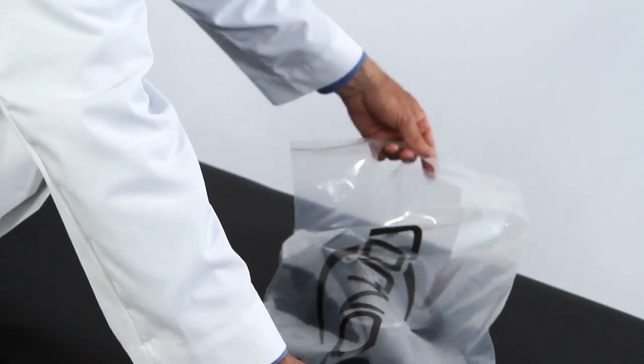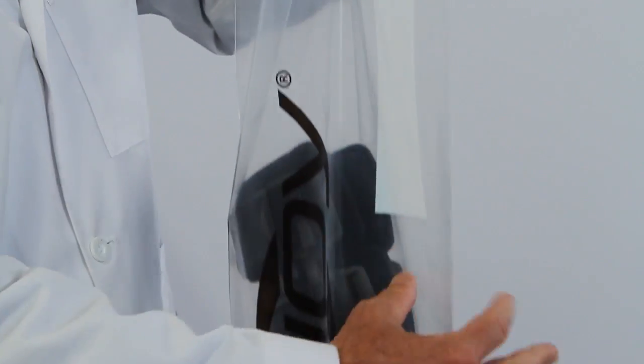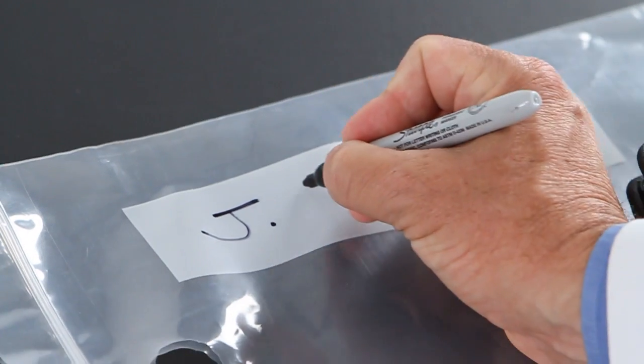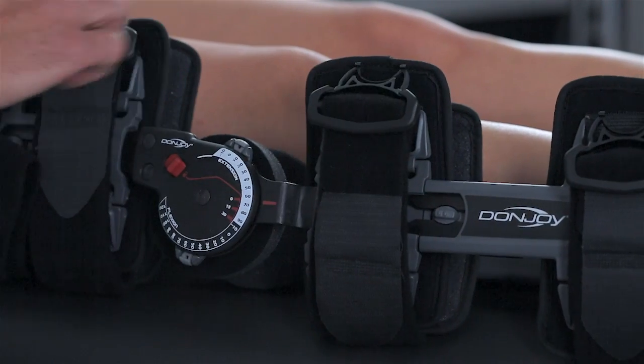The Exact ROM comes in a handsome bag with a ziplock top, handles that make it easy to carry and store, and a white space for the patient's name. For the easiest post-op application of the brace, fit the brace before surgery if at all possible.